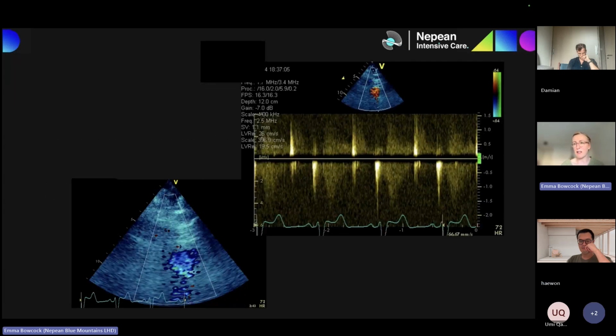And then the key thing that they would want you to say is, I want the balloon pump to come out, which is on the money, which is exactly what you said. So you would pass that STEM with what you just did there. I'm confident that you would pass that question, but just refining to come to the money a little bit sooner with that first plax view.